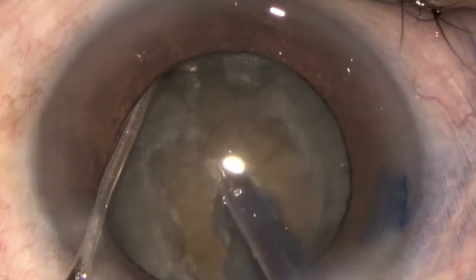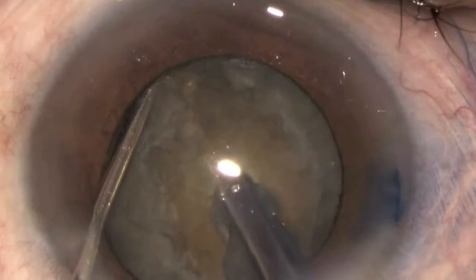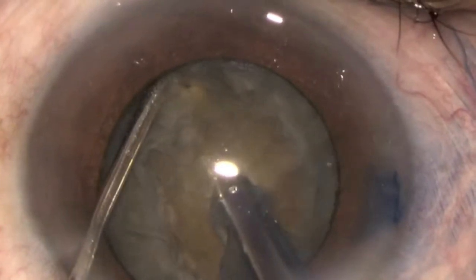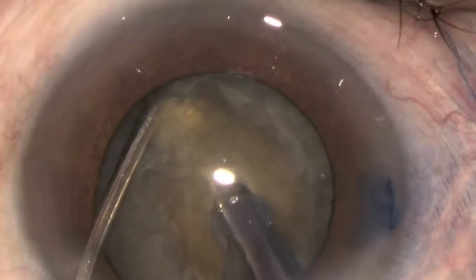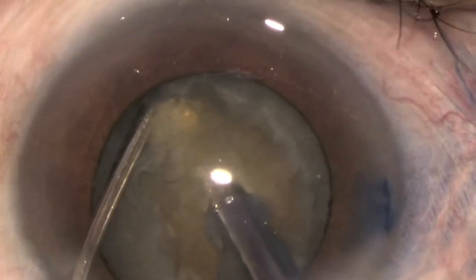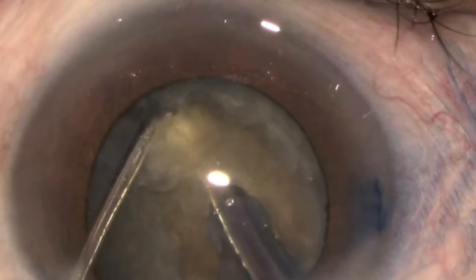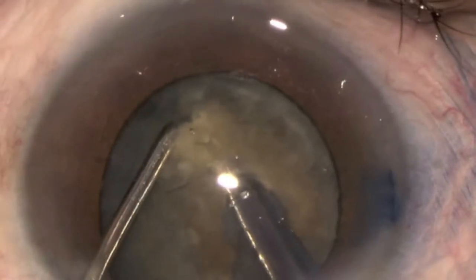While the nucleus is firmly held in position with the phaco tip, the equator of the nucleus is then slightly lifted vertically and brought out at the capsulotomy edge. The blunt chopper is then very simply hooked around the lens equator. The blunt chopper is then drawn just a mm into the thin and softer terminal edge of the nucleus to create a small, full-thickness nick adjacent to the phaco tip.